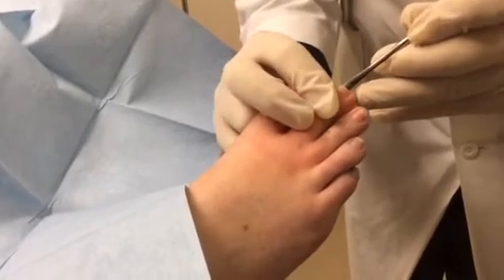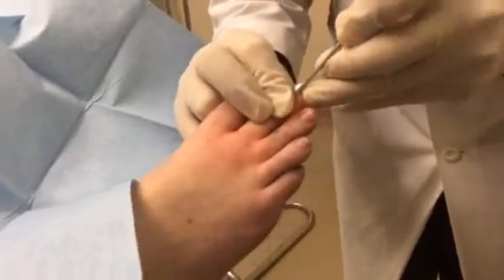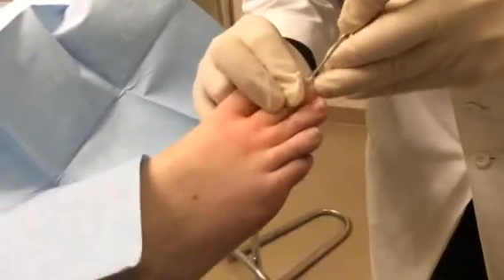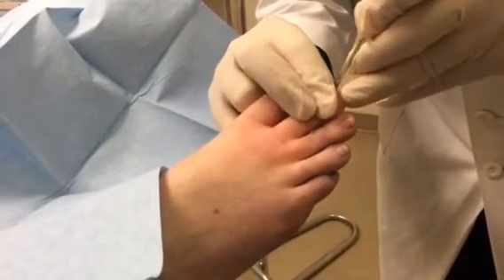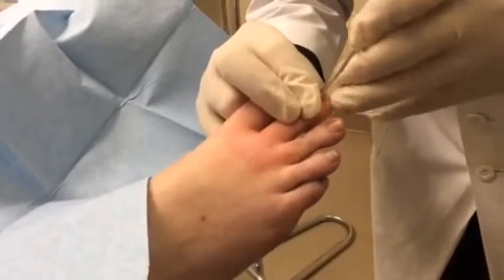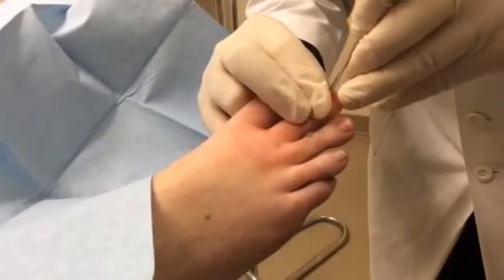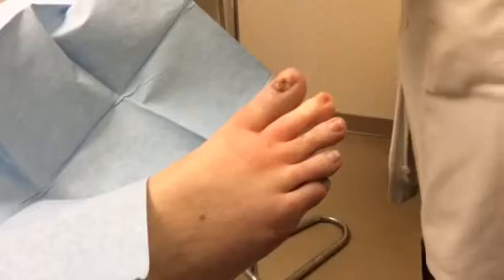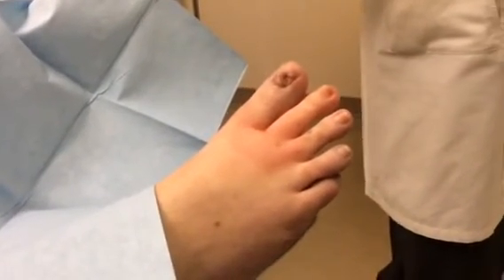This is just a matter of getting underneath it, loosening it up, and removing the entire nail in one piece. There's going to be a little bleeding while we do it, but you get a lot less after if you don't use a tourniquet. If you use a tourniquet, you get nothing when you do it, but then after, the blood kind of rushes back into it.